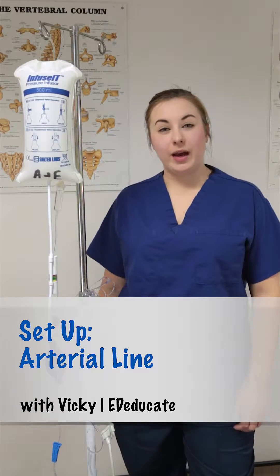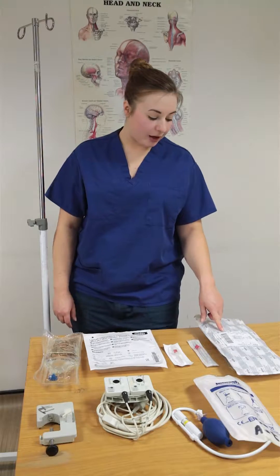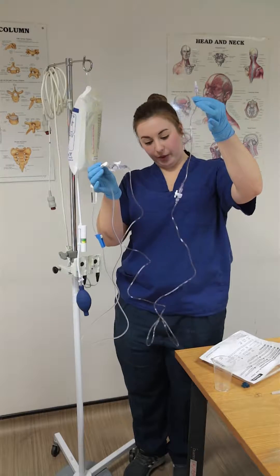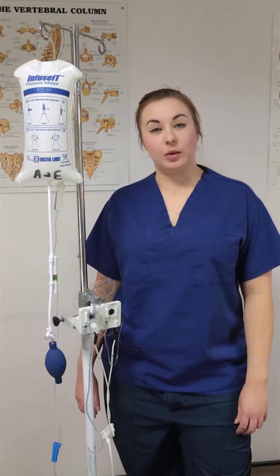In this video we're going to talk about how to set up for an arterial line. We're going to start with what kit you'll need, then we're going to have a look at what the nurse would be expected to do, and then we will be discussing some hints and tips towards the end.